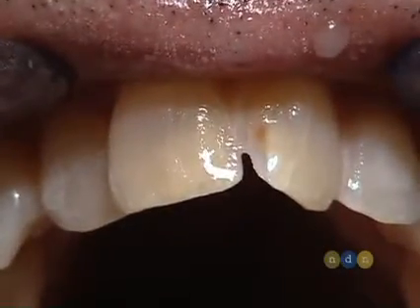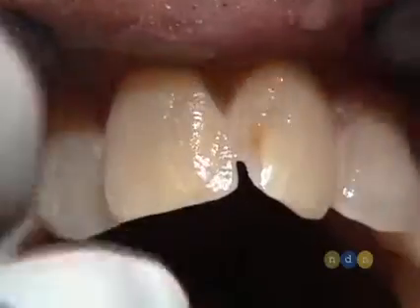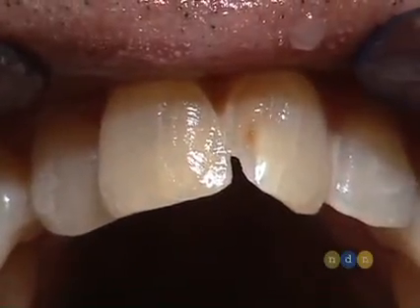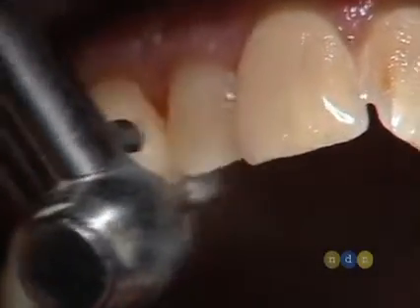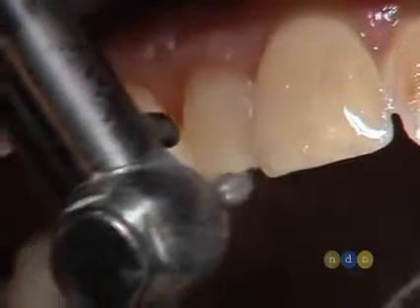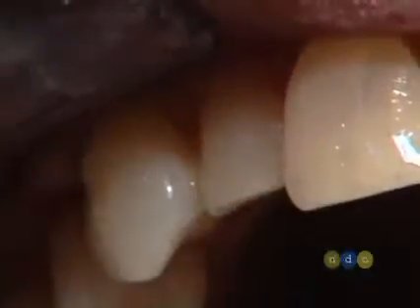Now the little more tricky part of this case is the lingual contour. And again, this is just recontouring the arch form. Tooth number seven is the one that really has to be brought out the most. What we're going to do is bring this forward, and by bringing it forward, we're going to have to reduce the lingual incisal edge to bring it forward. We're also going to have to do a little bit of tooth number ten.